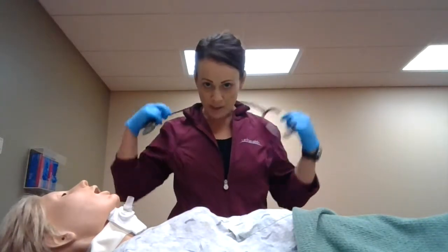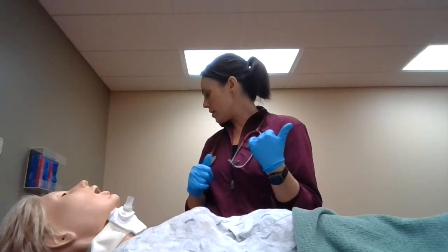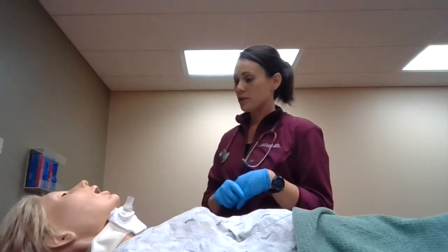We're going to do some trach care on Mrs. Smith in room 205. On my way there, I'm going to make sure I gather all my supplies. I'll need a trach mask, a trach care kit, a sterile suctioning kit, and PPE — probably a face mask because it can splatter back. Also some syringes and a resuscitation bag in case she needs to be manually resuscitated.